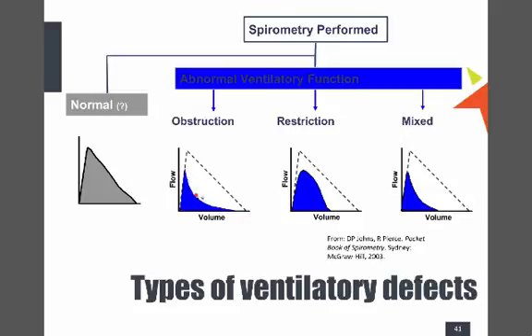The airways are narrow. You can hear them, and they've got that scoop. This is the typical COPD person, and you can hear them trying to get the air out. This is restriction. So this is where my flow might come out, but I haven't got all that volume to go. So my flows come out quite quick.